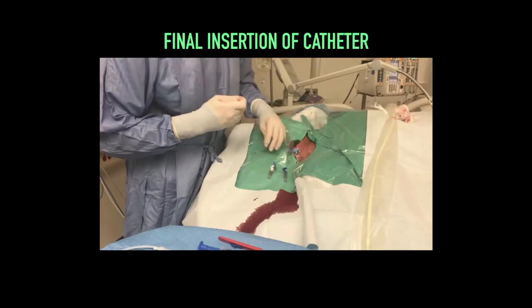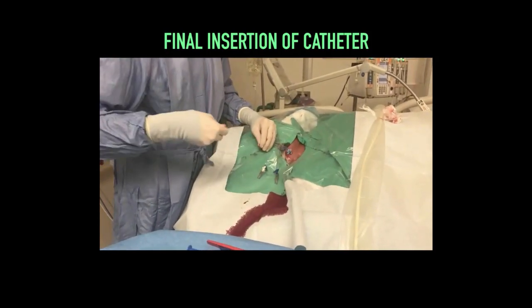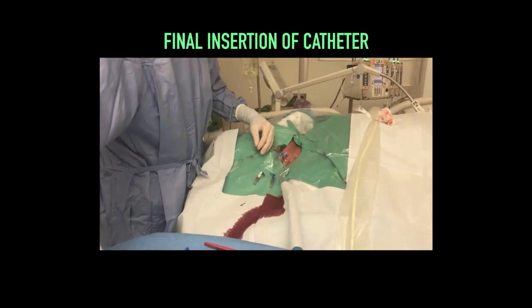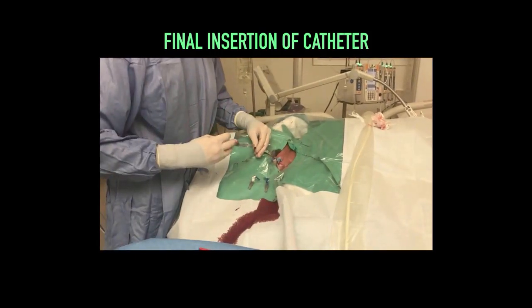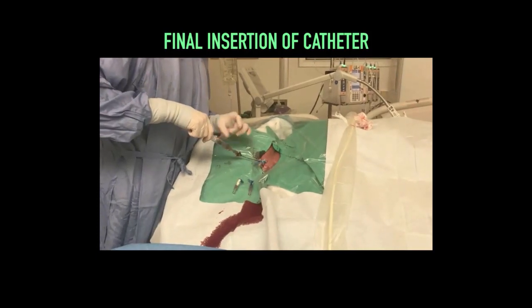The catheter is advanced all the way in this case, as it is a right-sided IJ and a 15 centimeter catheter. The wire is removed and the fingers are kept over the port to prevent a venous air embolism. Now the operator will withdraw from each port, flush the port, and then saline lock the port.